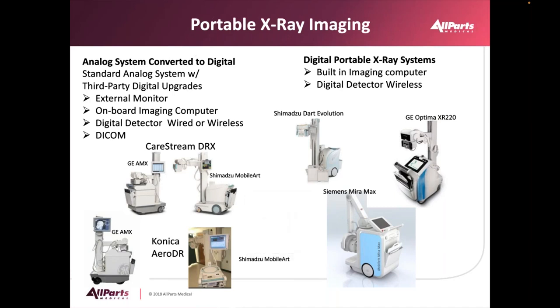On the other hand, you have the manufactured digital portable systems, which have built-in imaging computers and digital wireless detectors, such as the Shimadzu Dart Evolution, the GE Optima XR220 or 240, and the Siemens Mira Max.